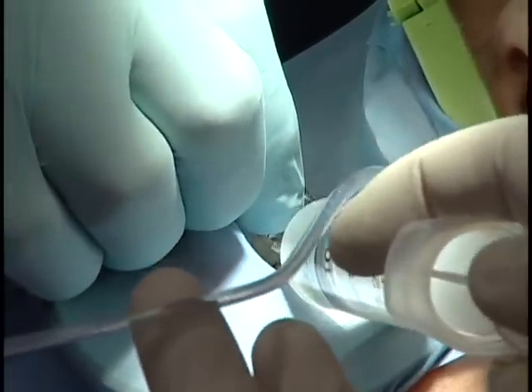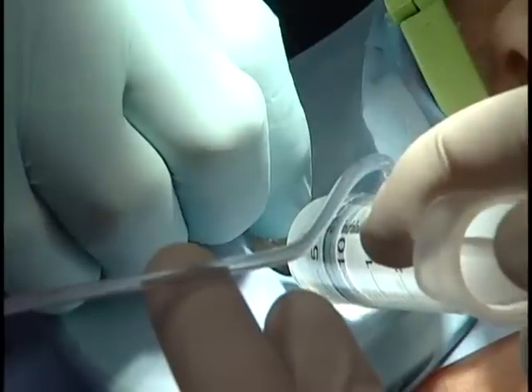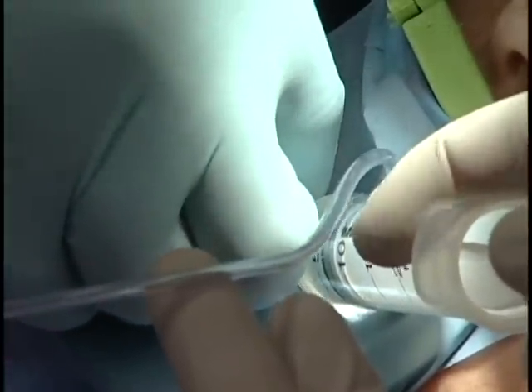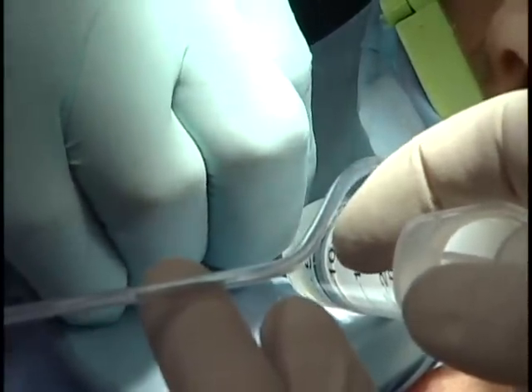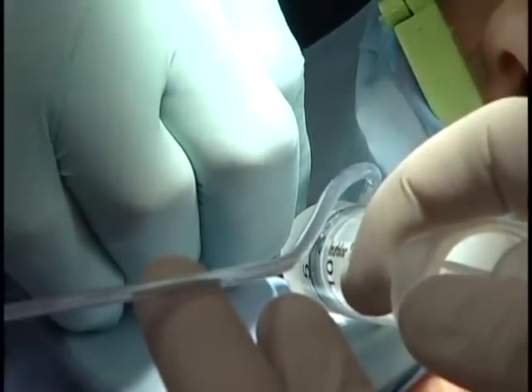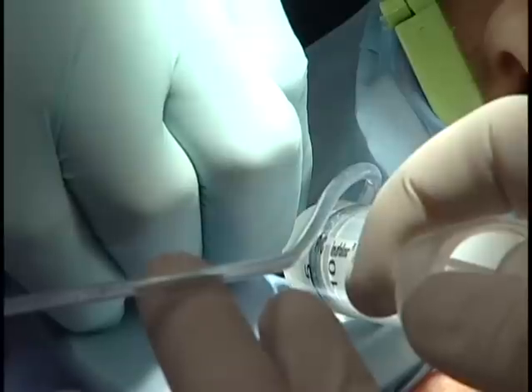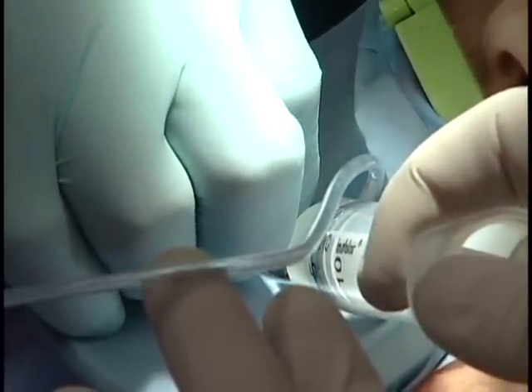Once placed at working length, I'll keep it there for 6 seconds, then I'll move back 2 millimeters coronally. I'll hold it there for 6 more seconds, then take it down 2 millimeters to working length again. This ensures that I remove a maximum amount of debris and bacteria in the canal by creating a machine washing effect deep into the canal.